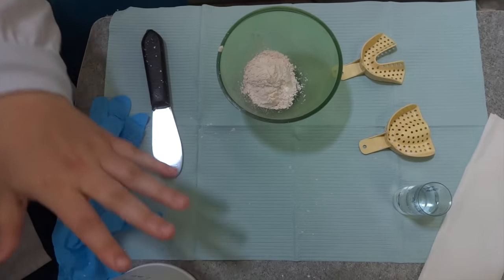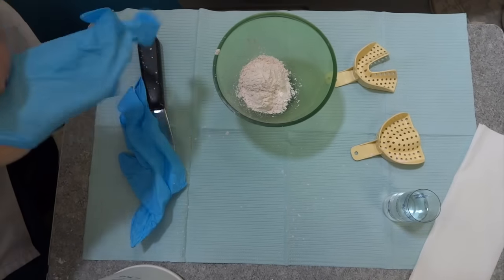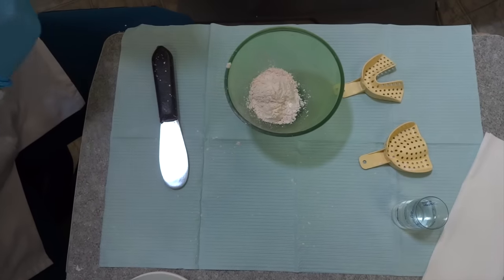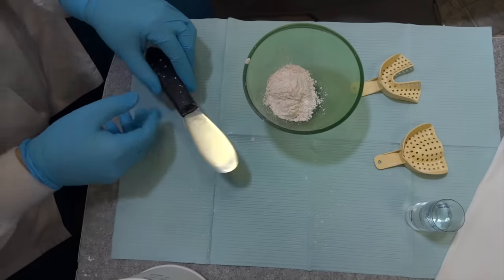Now you're going to want to put on your gloves to keep things clean. We're ready to mix.